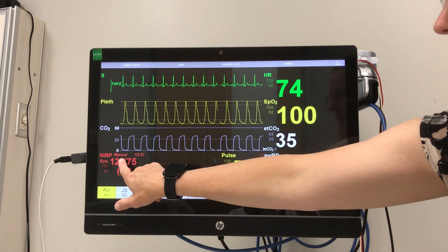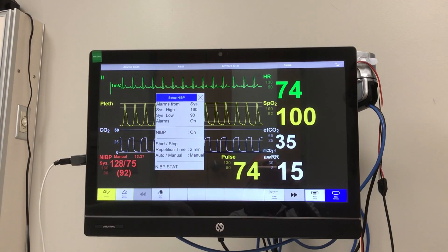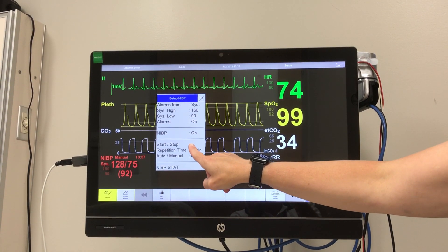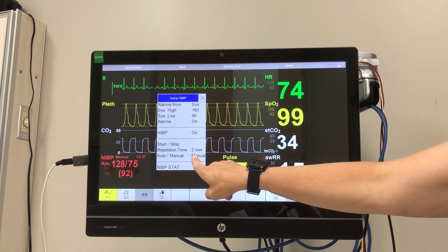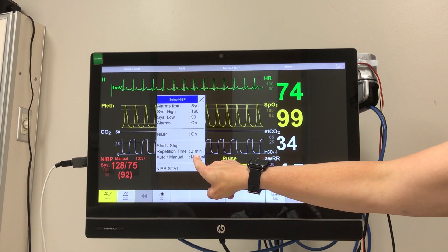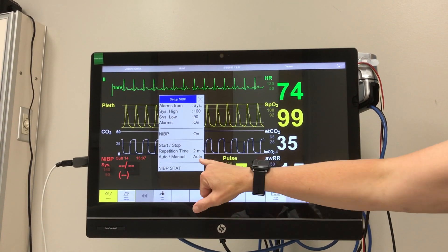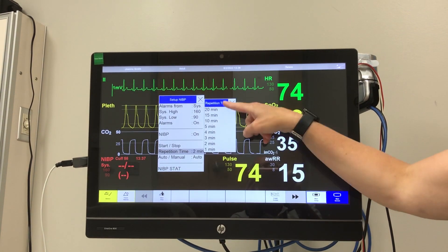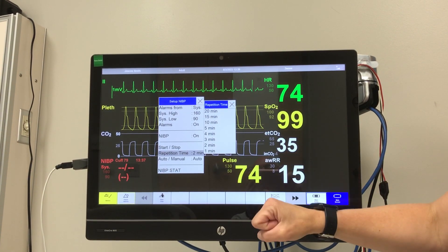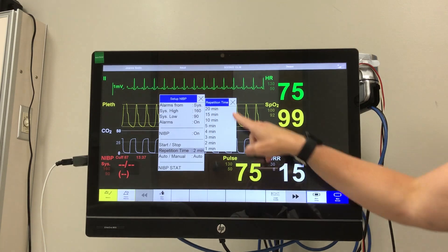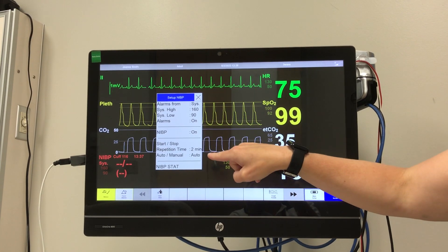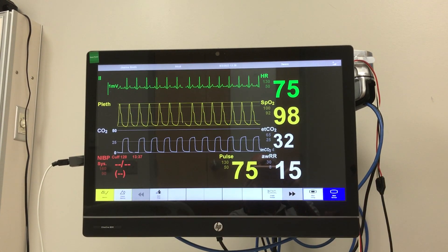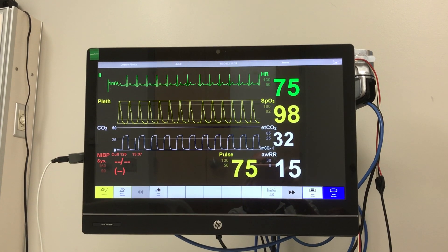Now that we have a blood pressure, if I click on that again, we can do repeat time — manual or auto. If I click on auto, now it's set for two minutes. I can change how often it does a blood pressure right there on that repetition time. So now it is set to do auto every two minutes.